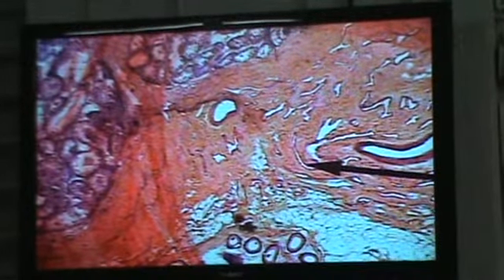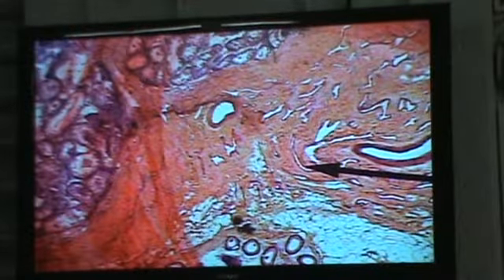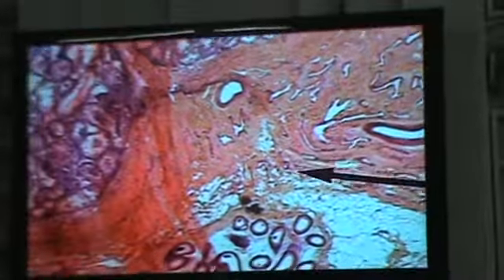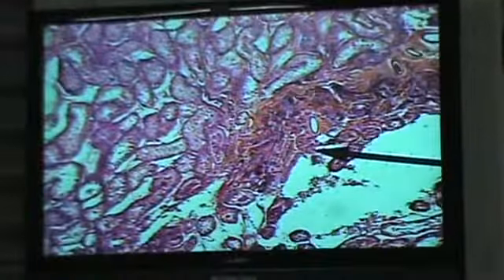Okay, so some of these are, tell me, what's wrong? The lower left? Yeah, right there? No. These in fact are the ductuli efferentes. And up here, the larger duct of the epididymis. So that's very good. So that's what we're looking at here now.